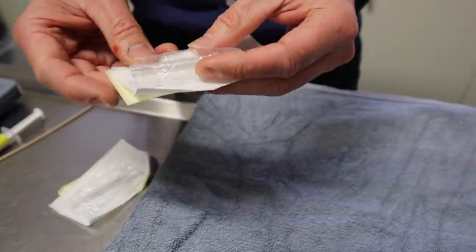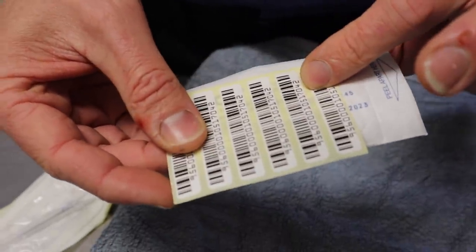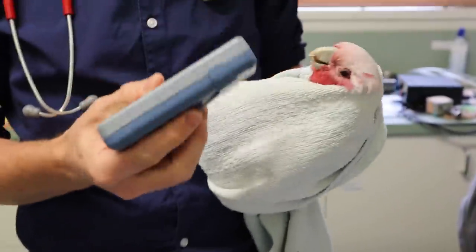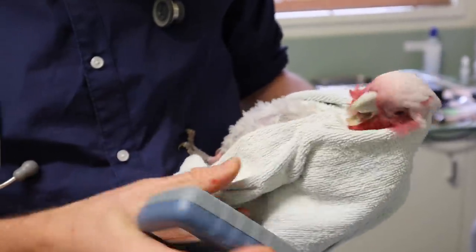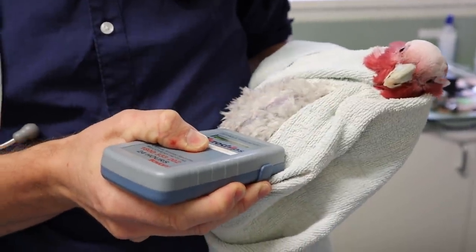Number one: a microchip is not a GPS or a transmitting device. You cannot track your bird through a microchip. The main premise of a microchip is identification. If a bird gets stolen, it can have its leg band cut off in an attempt to conceal the theft. To prove that bird is yours, simply hold up a microchip reader and it shows that unique microchip number with its registration to you. It's a great way to protect your birds from theft. Even if your bird just gets out, somebody finds it and turns it in — they can scan that bird and know it belongs to you.